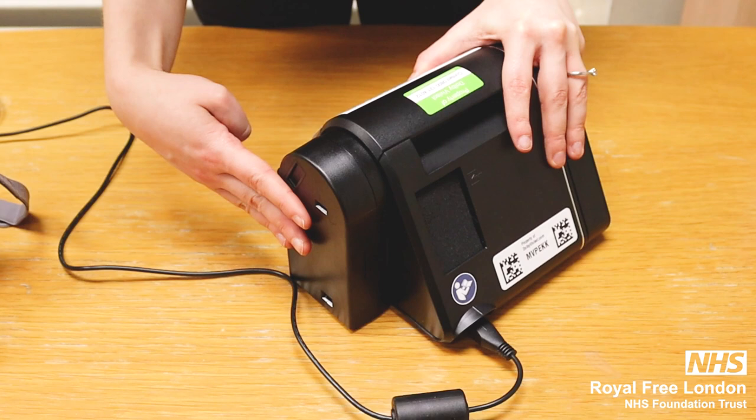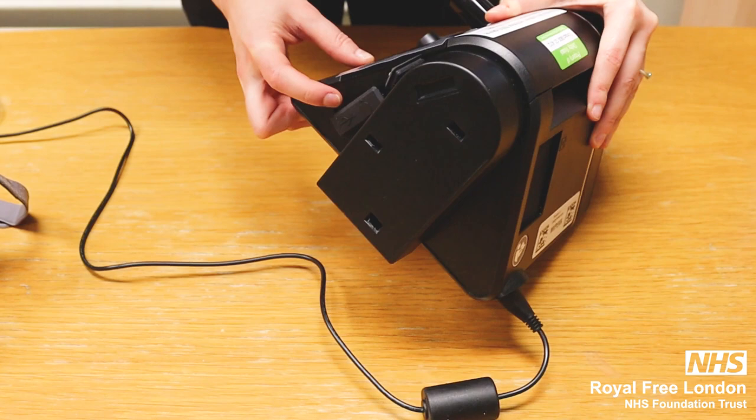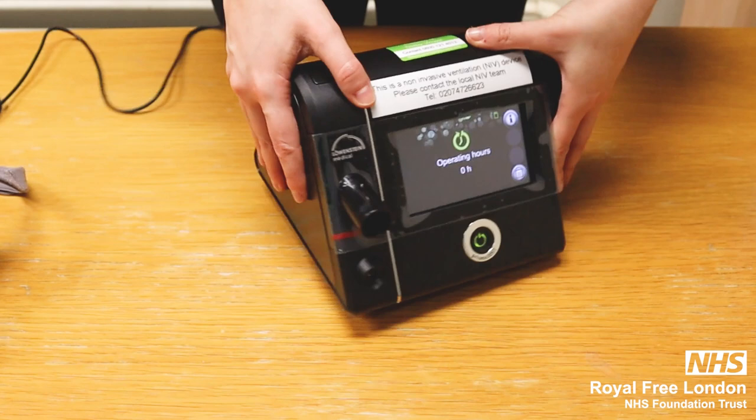On the side we have a modem which sends the data to us on a cloud, and also an SD card to save the data.